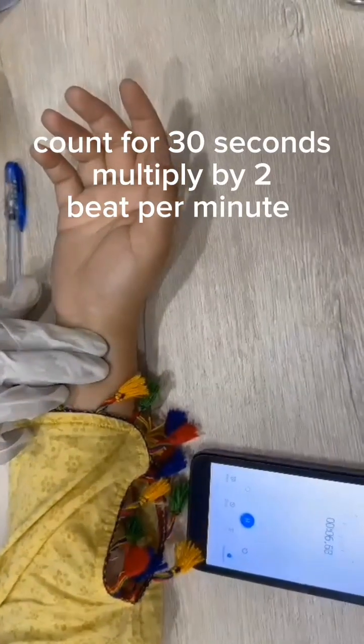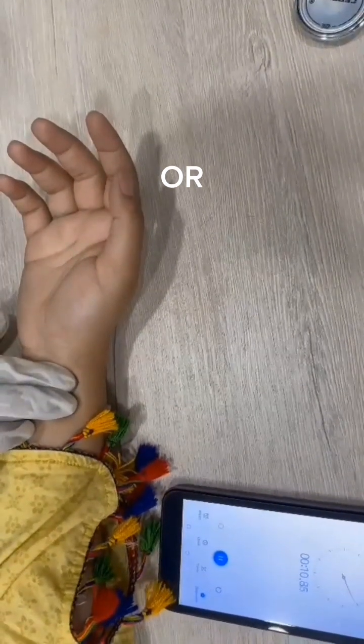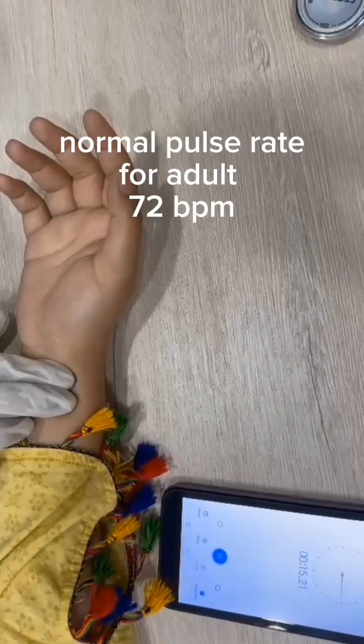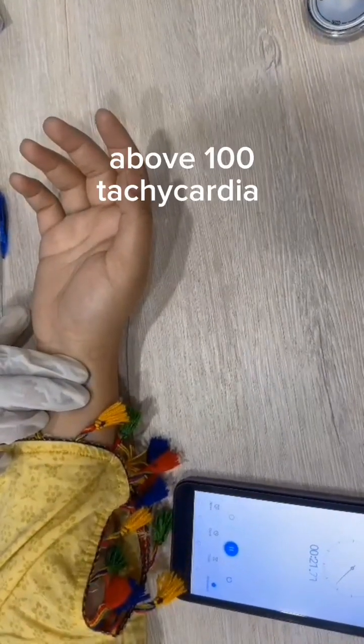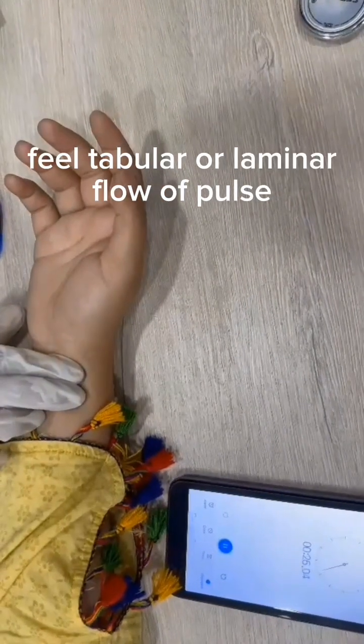Count the pulse for 30 seconds and multiply the value by 2, or count the pulse for 15 seconds and multiply the value by 4. Then whatever value comes will be your pulse rate. Normal pulse rate is 72 BPM. Below 60 is bradycardia and above 100 is tachycardia, meaning the pulse is high.